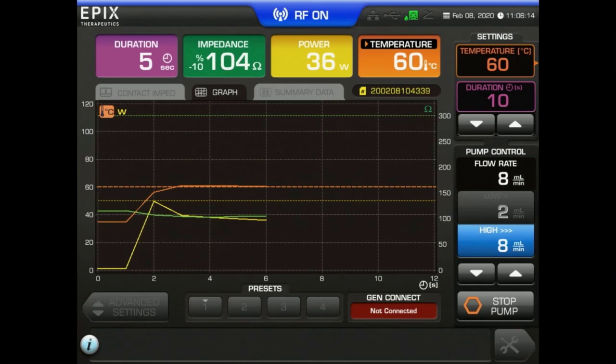The catheter, you want to have a unidirectional, a bidirectional, a small curve, a big curve. It replicates very well what we routinely use, and you take it in your hand. I feel like I know how to use this catheter. What is new is this display, and that's the only thing that is new. I don't know if you want to go through it.